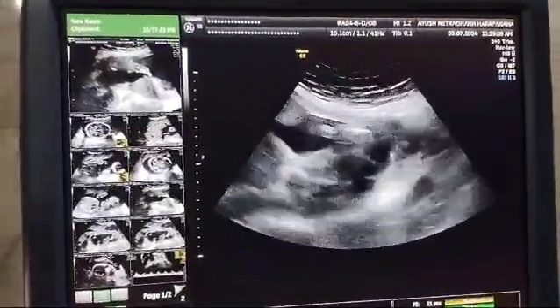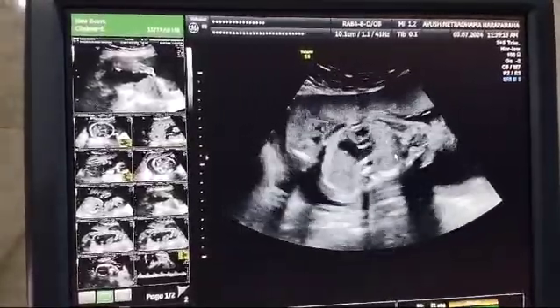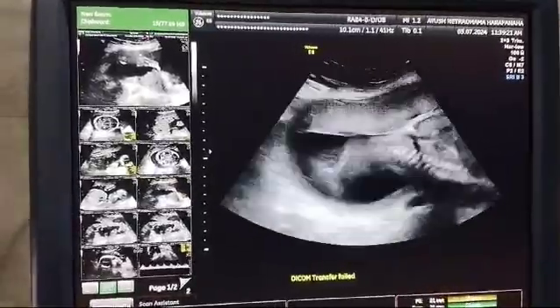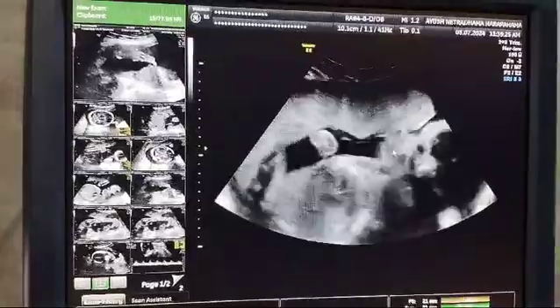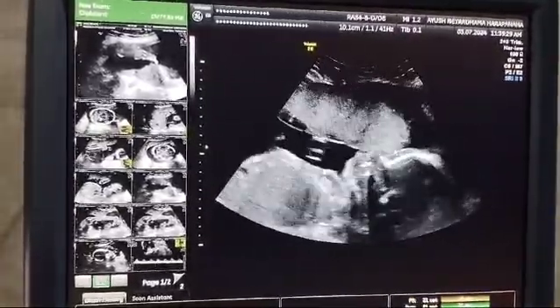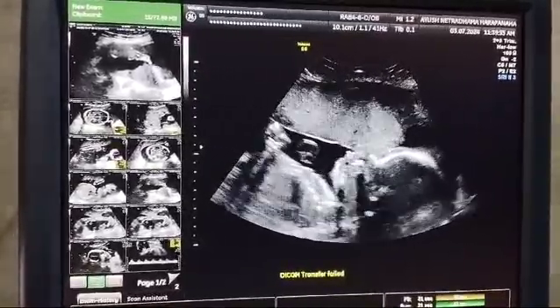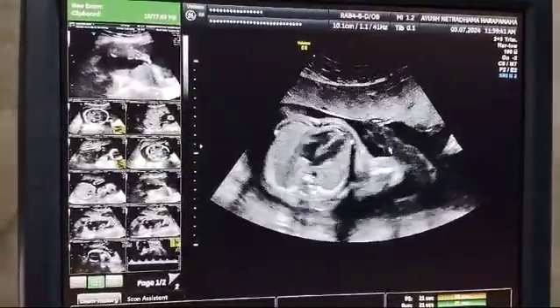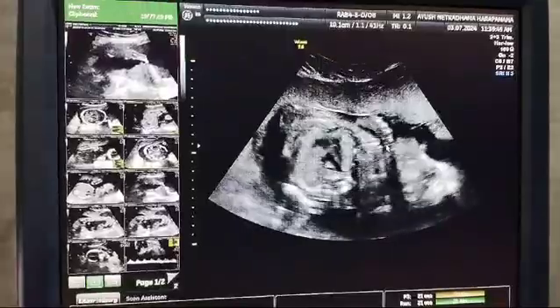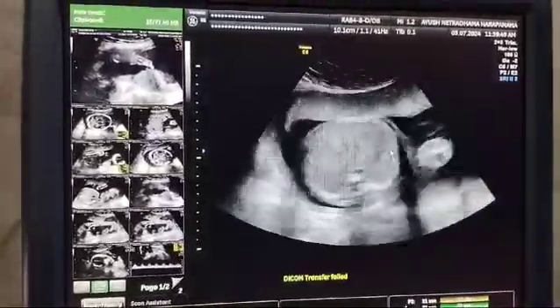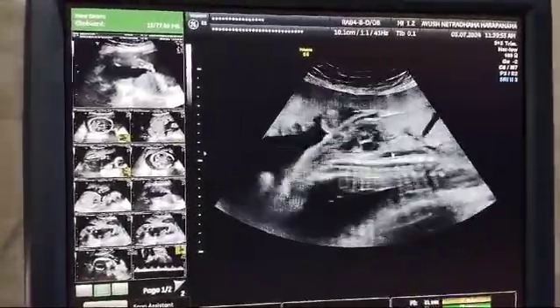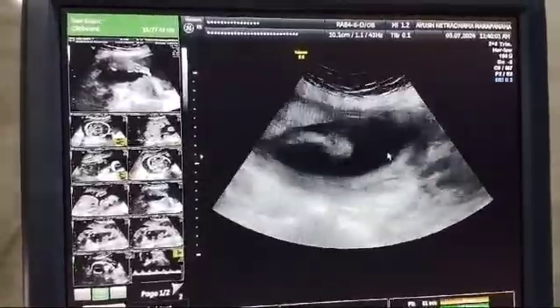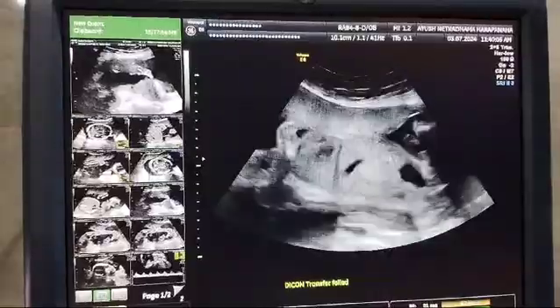Since this fetus has a unilateral club foot without any coexisting abnormalities, it has a good prognosis. Whenever we have a club foot, we should also try to look at the facial profile on the sagittal plane, and carefully look at the cardiac four chamber view, the three vessel view — which looks fairly normal — and also the spine. We should also look for other syndromes. Since this is a unilateral club foot, it has a good prognosis.